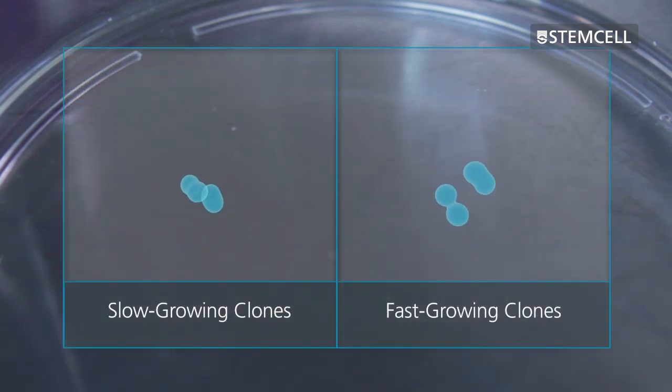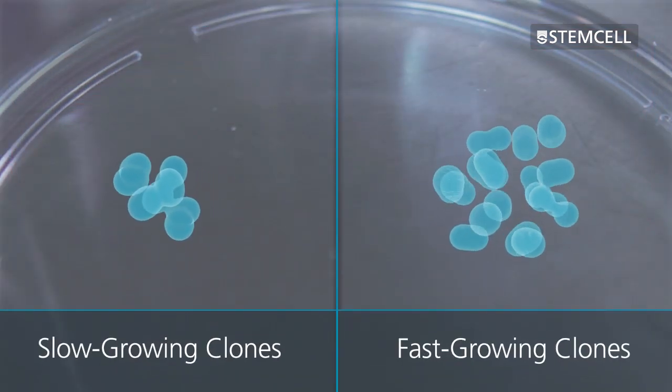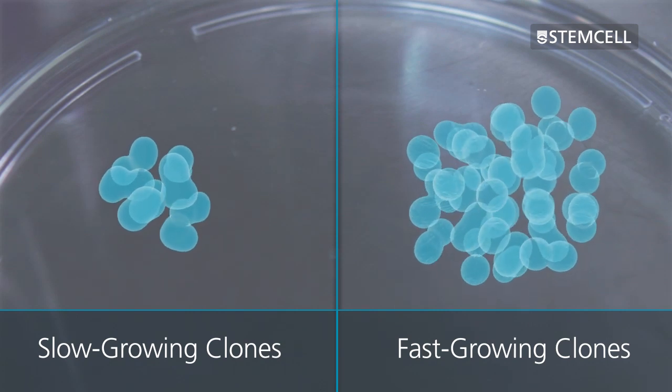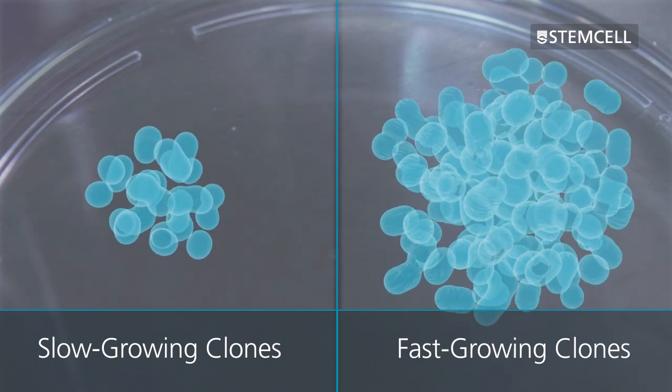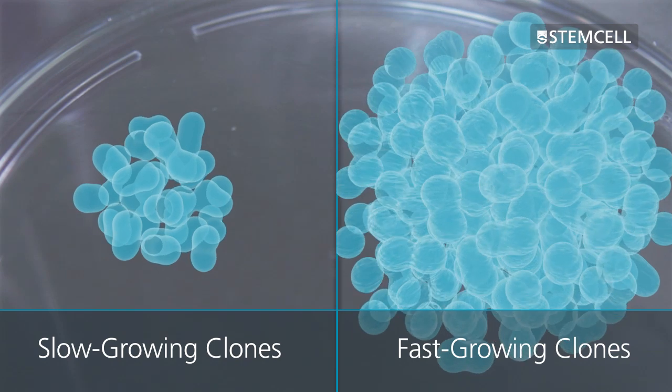With semi-solid cloning, both slow and fast-growing cells grow into discrete colonies, making it easier to isolate rare, high-producing clones.